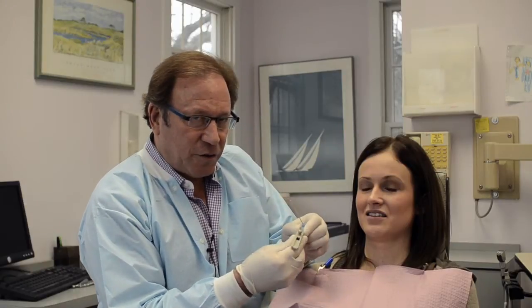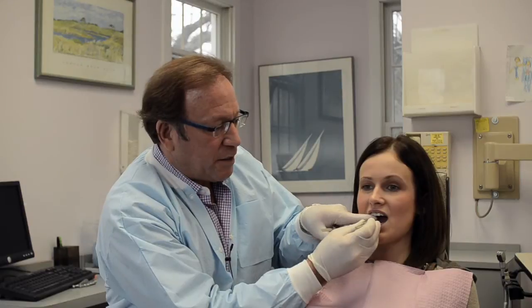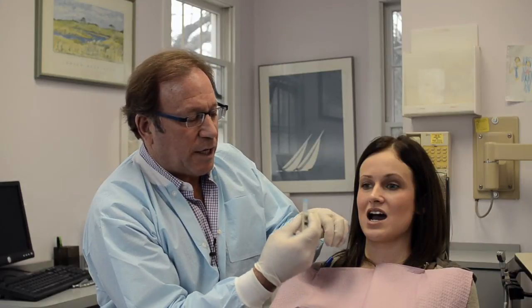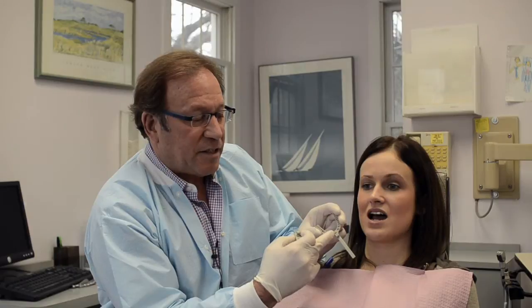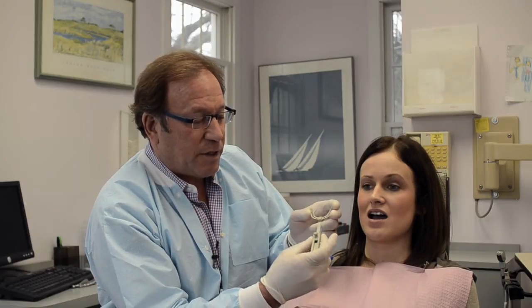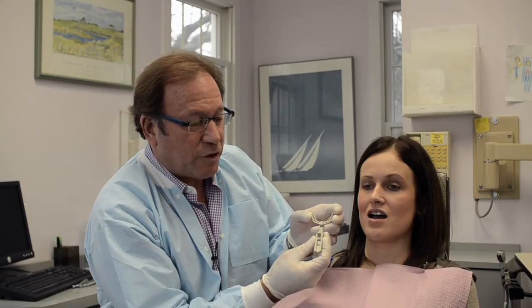First, we adjust the George gauge to receive the incisal edges of the lower teeth. We place it on and then tighten it. So the incisal edges of the lower front teeth go into the lower notch. The bite fork assembly has a notch for the upper teeth. Then we put them together, and there's a scale, and that's how we measure the range of motion.